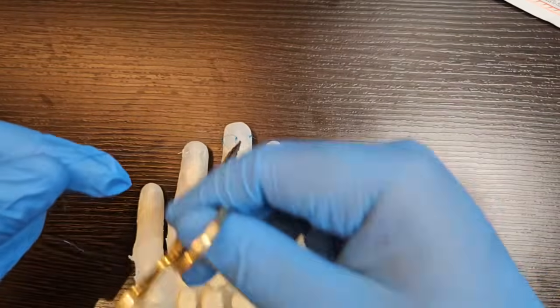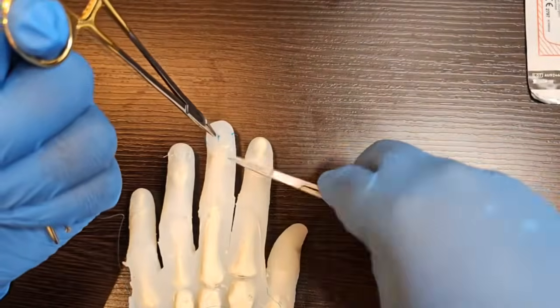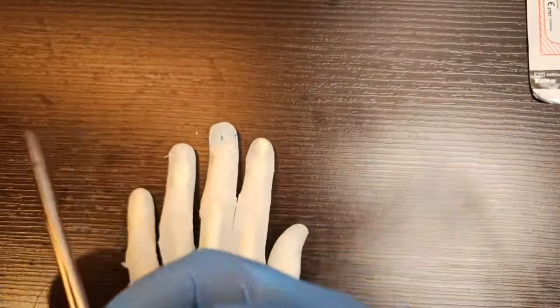Economy of movement. Bring everything into one hand. You cut and you place.